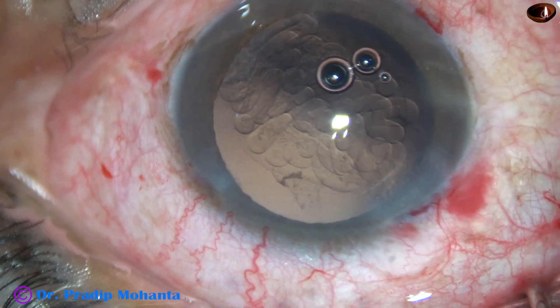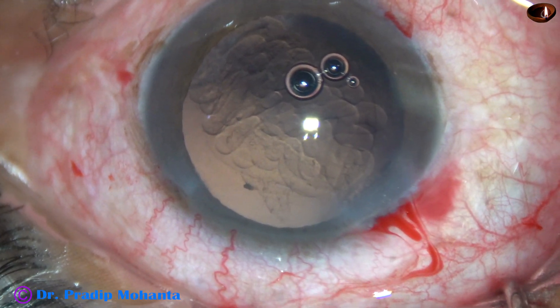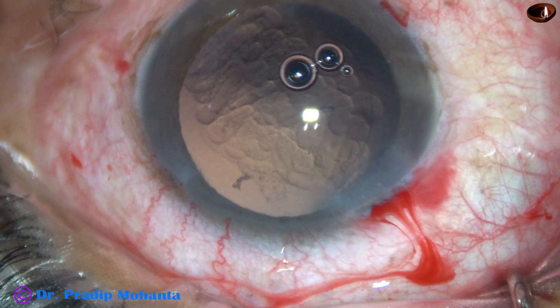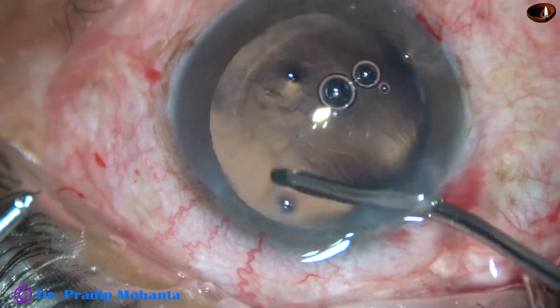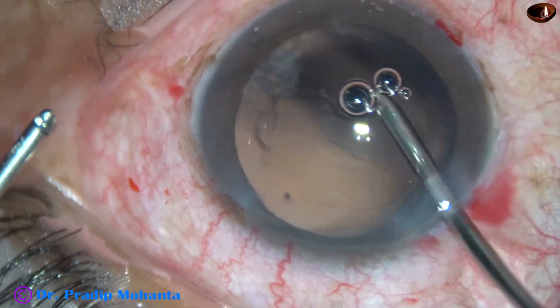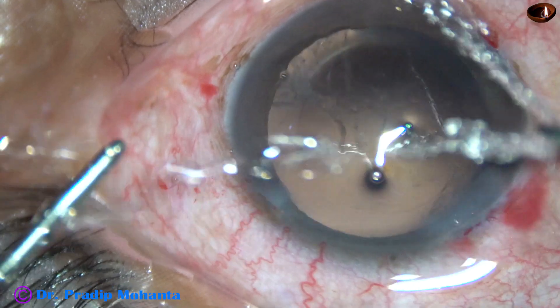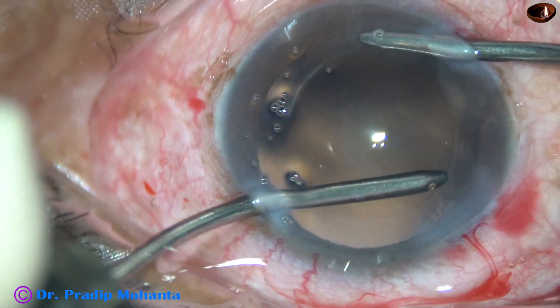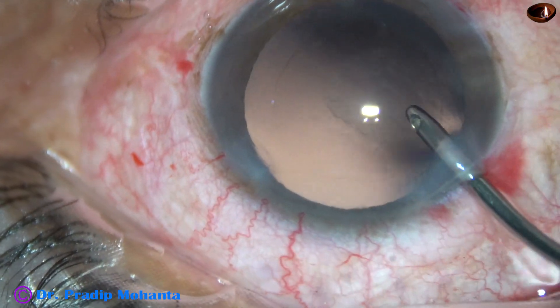A little bit of viscoelastic is injected. Now I am going to use bimanual irrigation-aspiration for removal of some cortex at 5 o'clock, and I am going to polish the posterior capsule. This is hydro-polish — the posterior capsule is nicely polished by the irrigating fluid. We don't have to touch the posterior capsule; we just have to move the irrigating fluid over it. Whatever cortex was there has been removed.